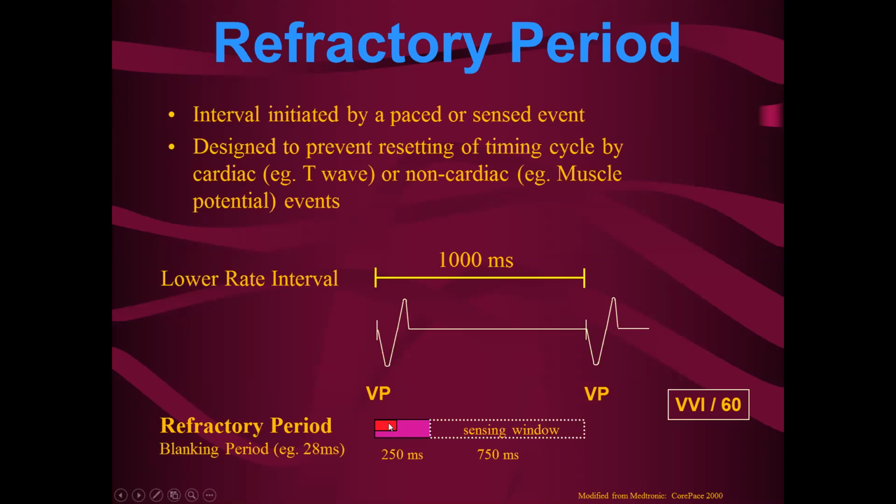It's designed to ignore the pacing stimulus, in case the pacemaker is able to pick it up, because the pacing stimulus is such a large signal that it can be oversensed. So the blanking period is designed to avoid the pacemaker oversensing the pacing impulse.